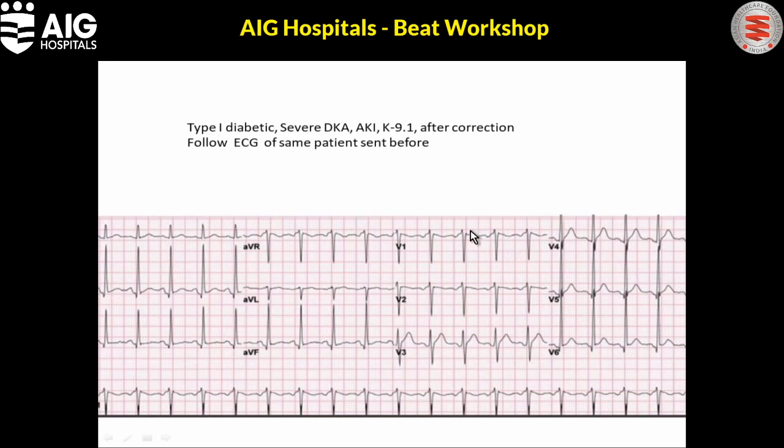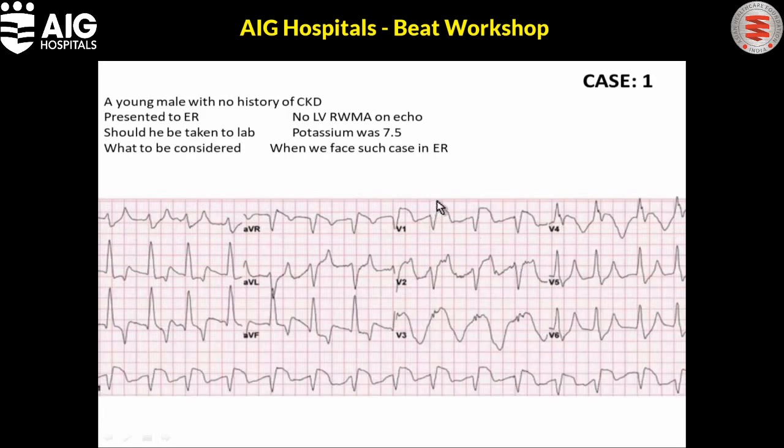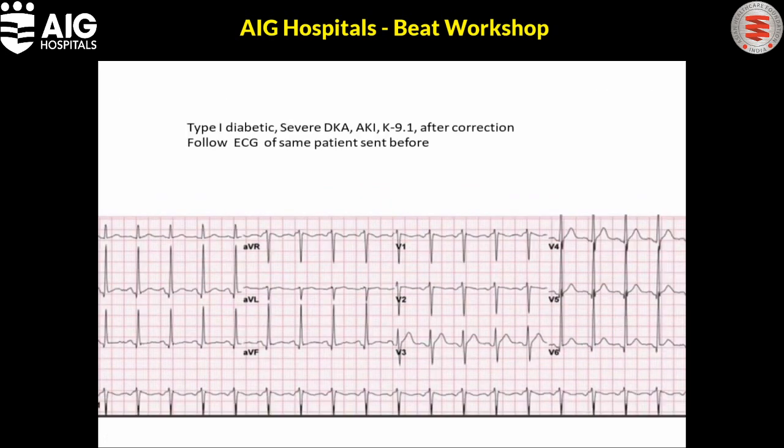You can see that they call this a dialyzable current of injury. Dialyzable, that is, when you dialyze, this current of injury will resolve, and that's why it's called dialyzable current of injury, and it will completely resolve once you correct the hyperkalemia. This patient, after treating the hyperkalemia, looks much better. And one of the things to resemble this kind of a thing is they can have concomitant coronary spasm. You should be aware of that.